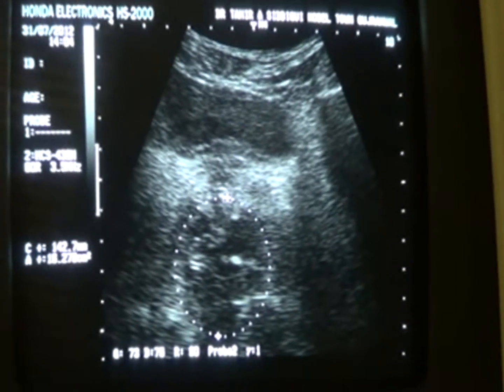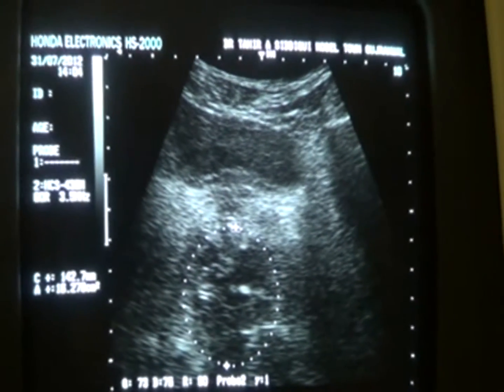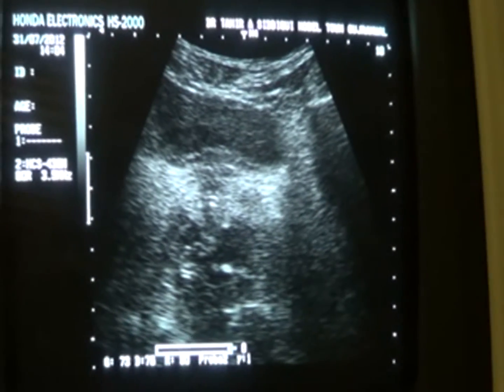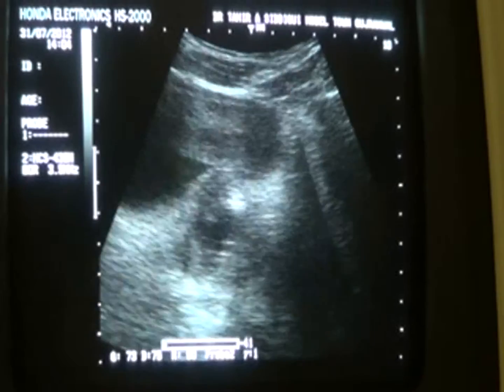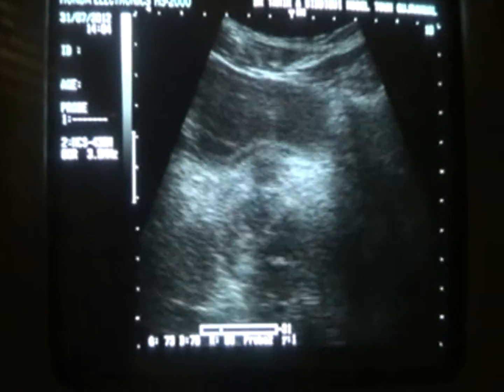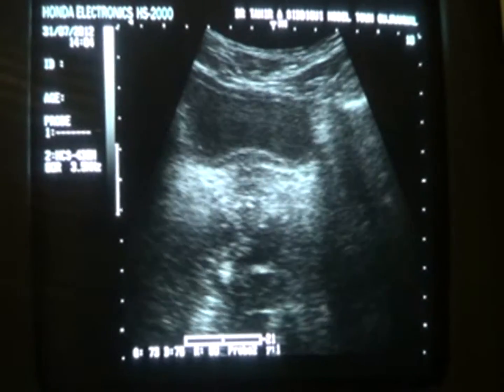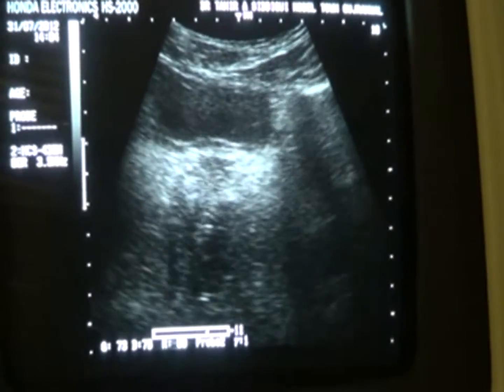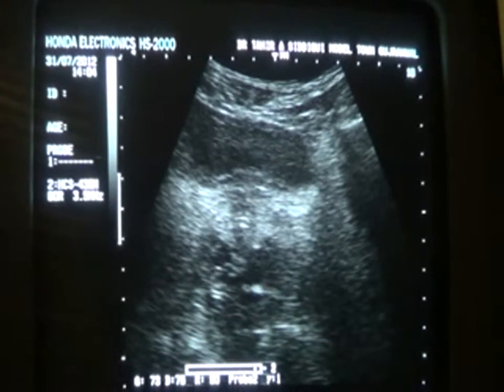until proven otherwise, as I don't have any clinical examination notes, no prostatic exam notes, ER, or any other laboratory investigations with me. The only complaint being dysuria by the patient, and the patient being referred to perform the ultrasound of the abdomen and prostate. So this is what we saw. These are prostatic abscesses. One is in the peripheral zone, one is in the posterior zone. Both are sonographically consistent with being infective in nature, as we see internal and marginal calcification with internal debris, and the sonographic picture is very much consistent with two prostatic abscesses until proven otherwise. Thank you.